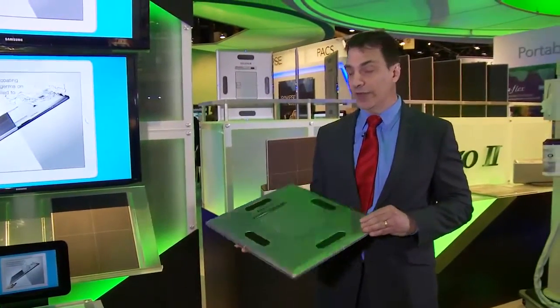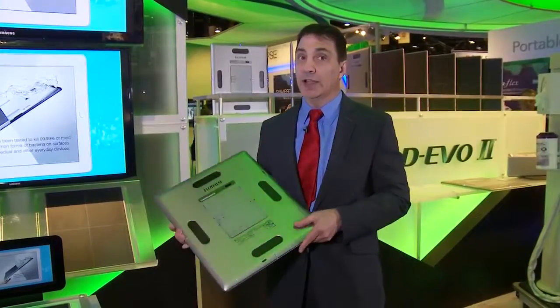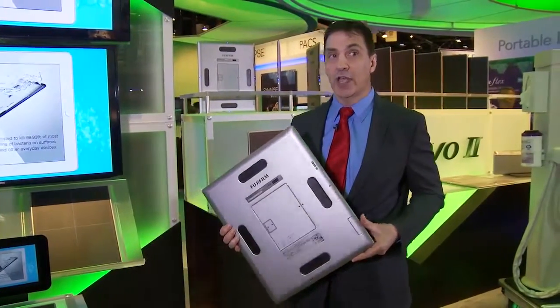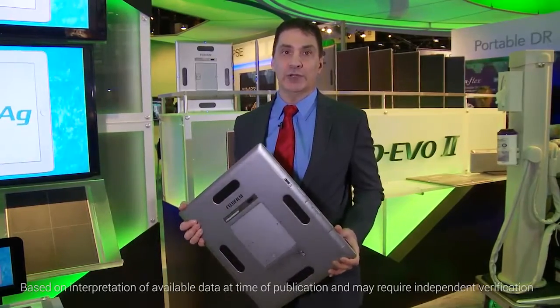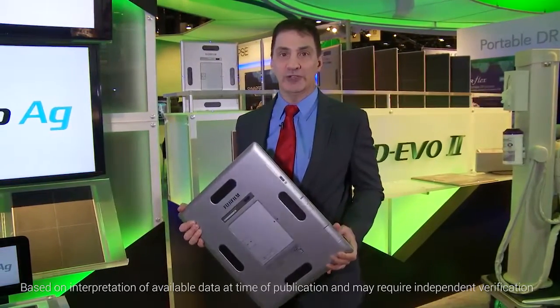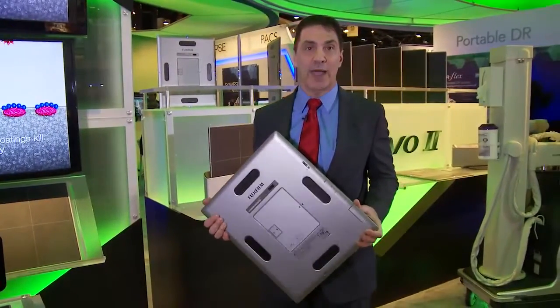Starting from the outside, the detector features a magnesium alloy casing designed to be a lot lighter than traditional detectors and a lot more durable. This detector features the highest point load and highest distributed load weight resistance, and is the lightest weight detector on the market with a replaceable battery.